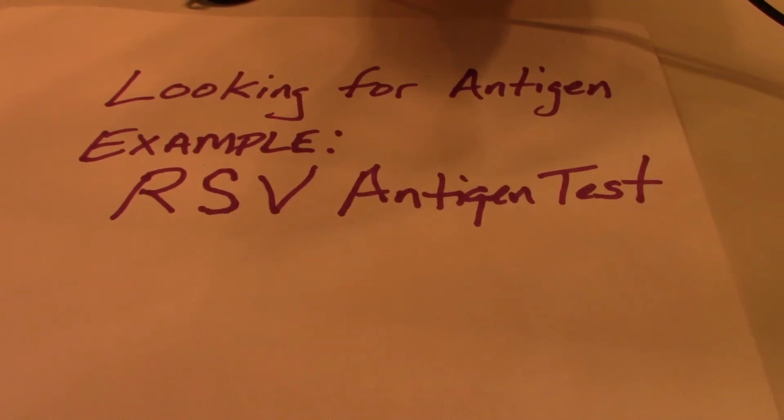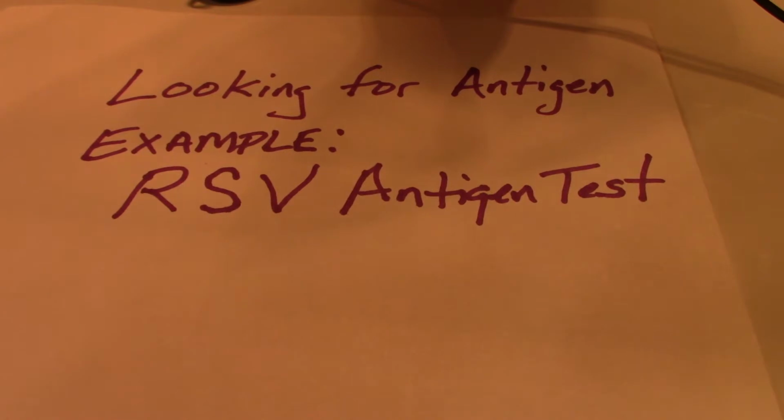The particular test we want to look at now is one that tries to detect antigen in a sample. This particular example is the respiratory syncytial virus antigen test.